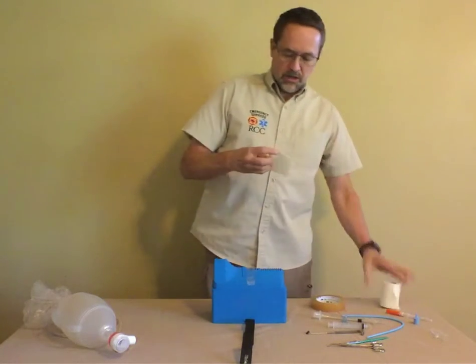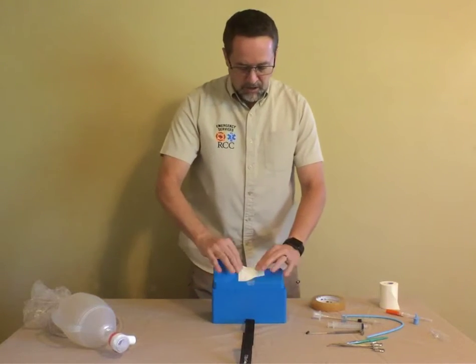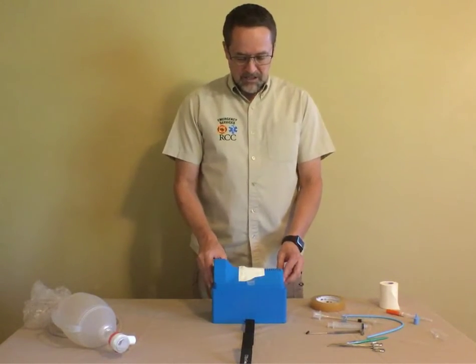You can tear or cut a piece of tape that's an appropriate size and lay it over the top. Once you have that done, you're ready to go and ready to proceed practicing this skill.